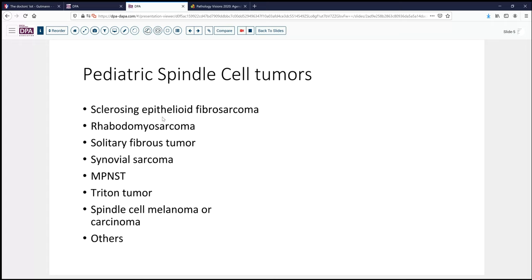Rhabdomyosarcoma, although usually of somewhat different morphology than we see here, does have a variant that might have this appearance, but is relatively uncommon in the pediatric age group. Certainly synovial sarcoma, of the more monophasic type, would be a consideration. We might also think about nerve sheath tumors — malignant peripheral nerve sheath tumor, or maybe a triton tumor — or less likely spindle cell melanoma; carcinoma is not terribly likely in this age group.